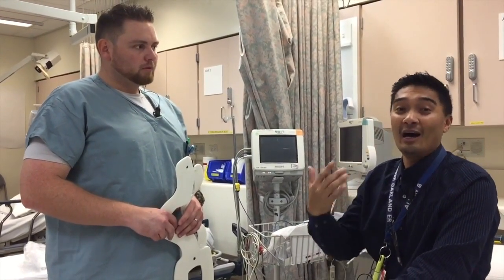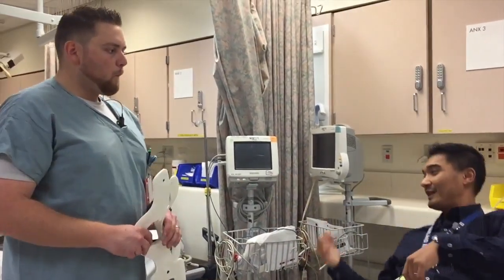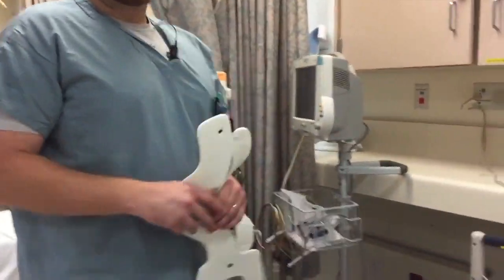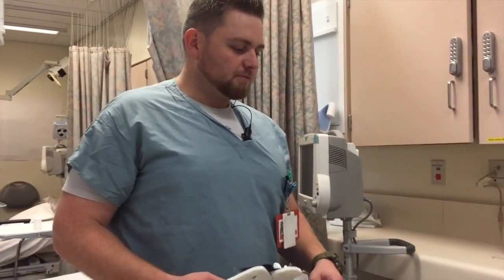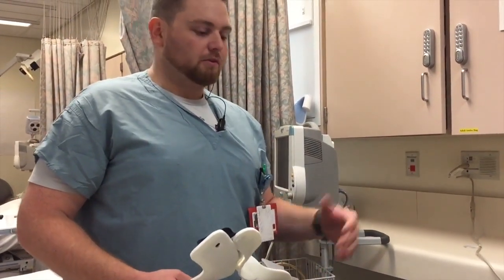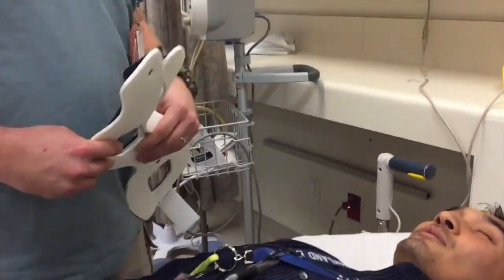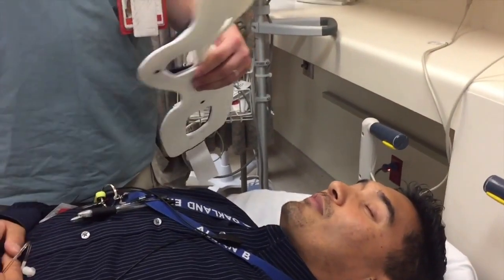I'll be the patient for right now. I'm going to go ahead and lie down. Jake, one of our ED techs, will demonstrate how to properly measure it. So anytime the determination has been made to put this patient in C-spine, we always have someone else holding C-spine at this time so they're not moving around while we're gathering this stuff together.